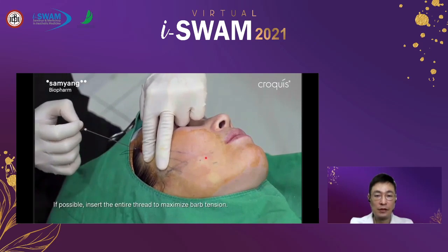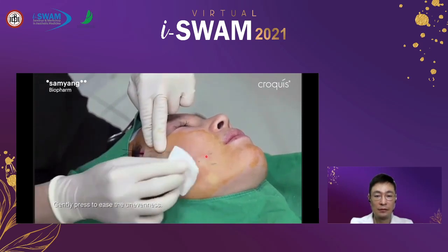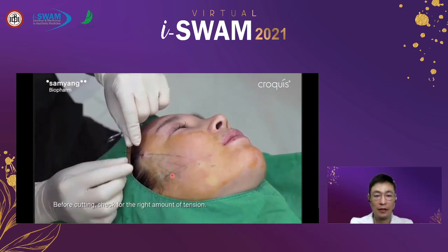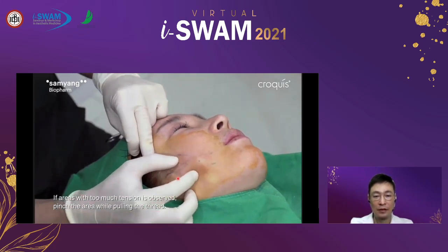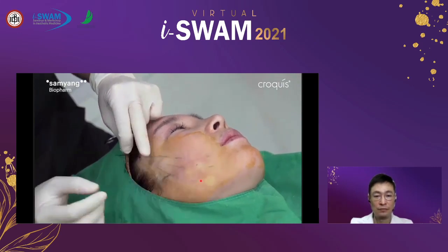The rule is not crossing this line, but a little crossing, I mean one or two centimeters crossing the line, is okay. But do not advance too much.